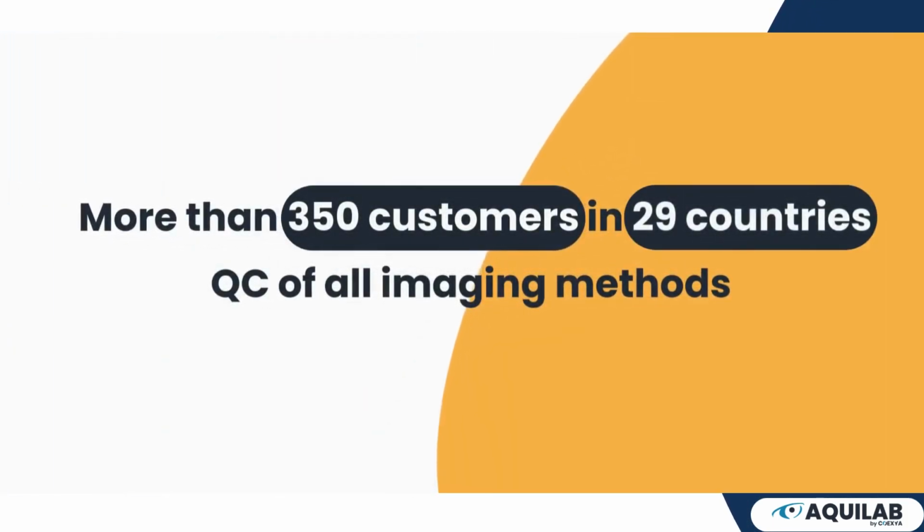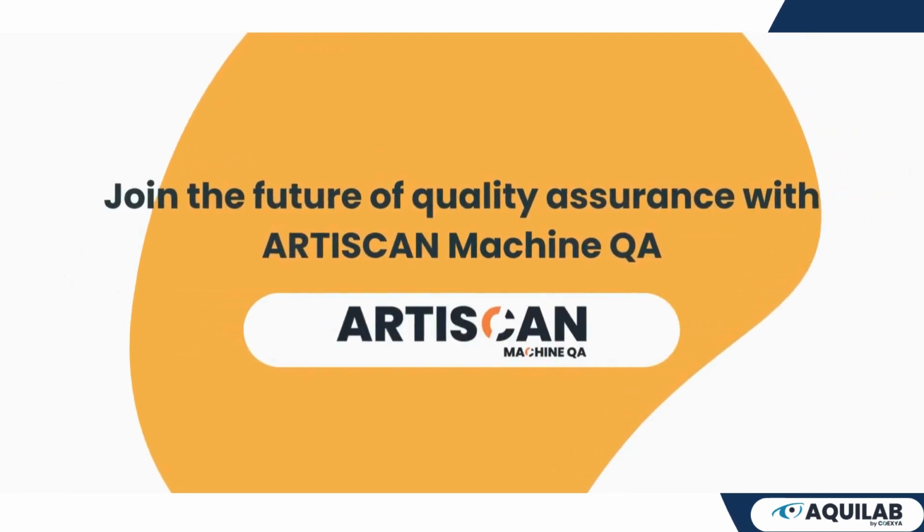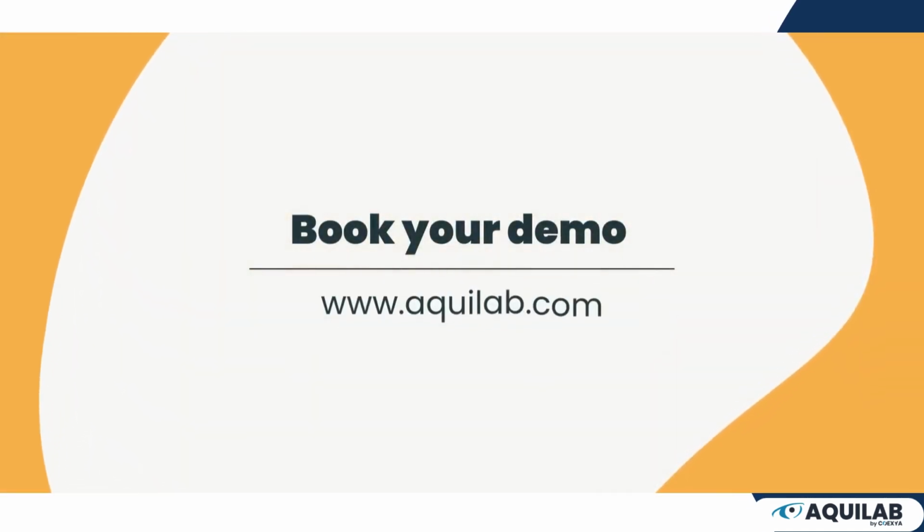In conclusion, ARTISCAN Machine QA is more than just a software solution. It's your partner in excellence. Join the future of quality assurance with ARTISCAN Machine QA. Elevate your standards, elevate your practice.